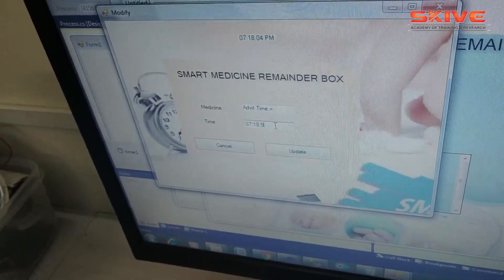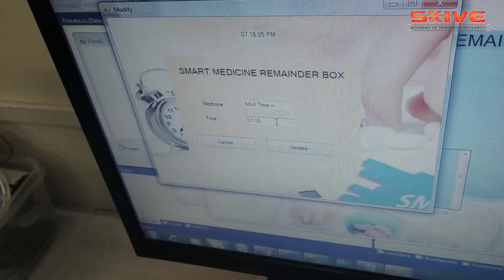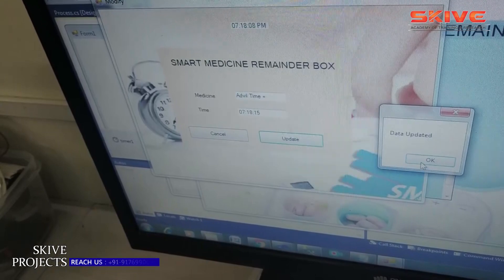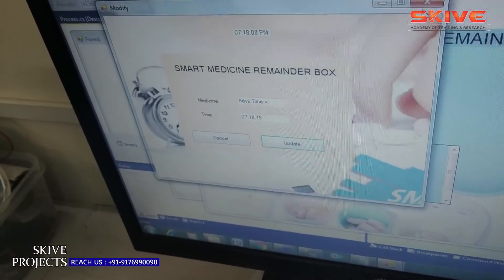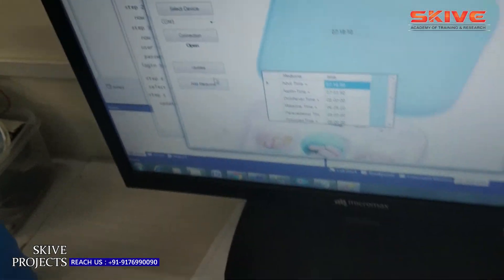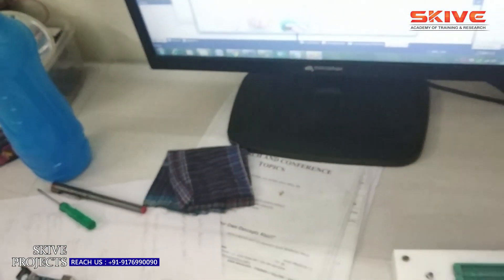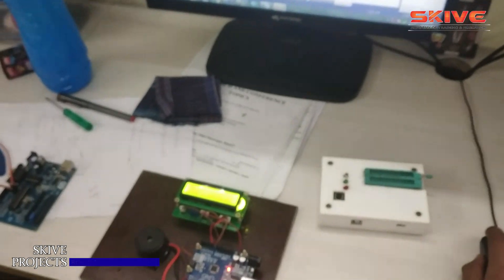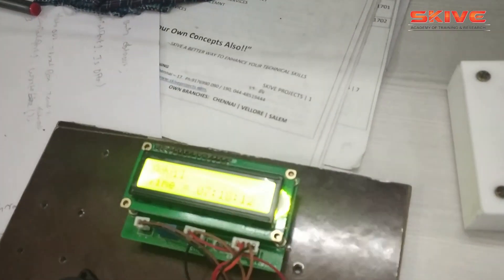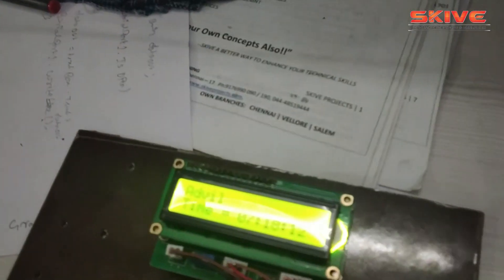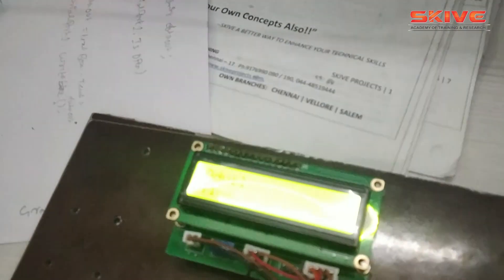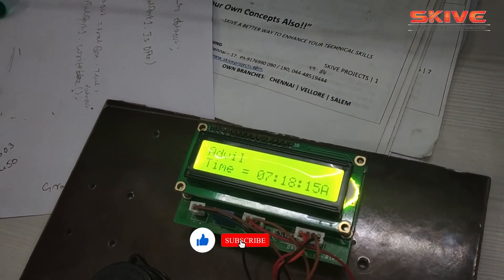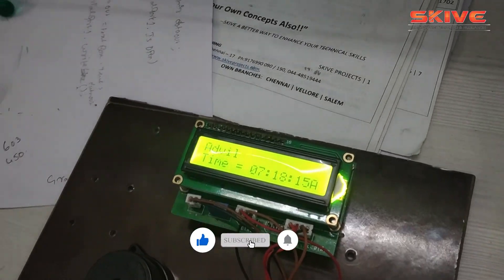We can get an alert system in the medicine reminder box. This is an electronics and communication based project, designed as an open circuit. We can integrate the entire concept into a small medicine box and demonstrate it. If you require this type of project, you can contact us. Thank you.